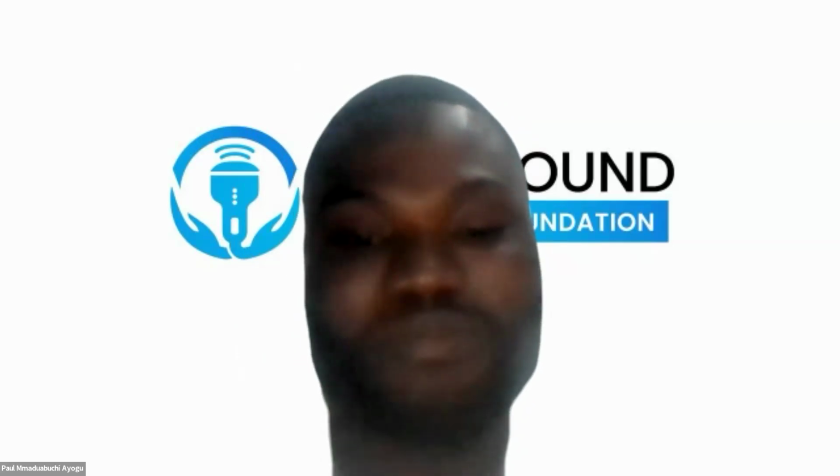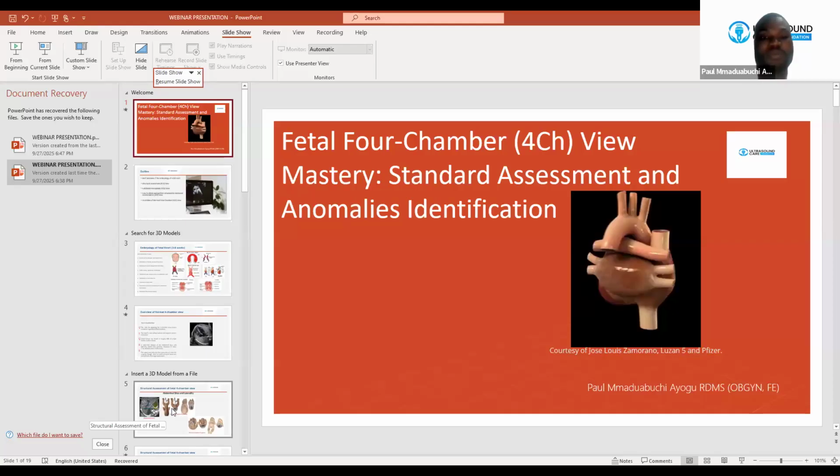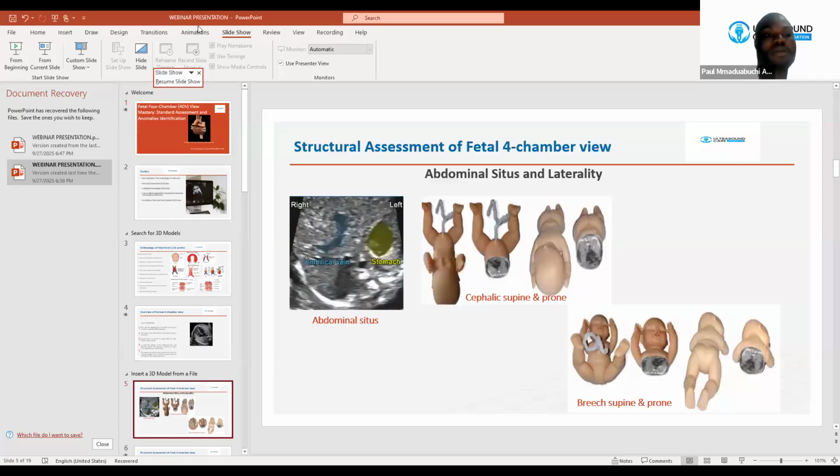Sorry for taking us back. Using this, if you look at these, you can see the stomach of the fetus, and you see the umbilical vein.